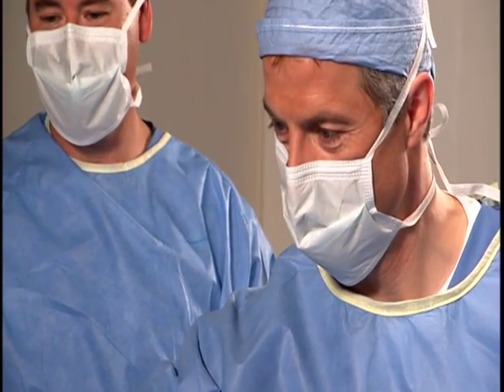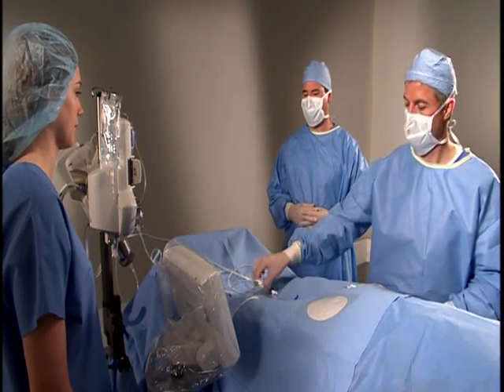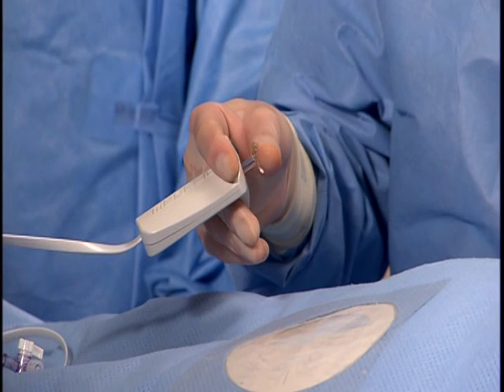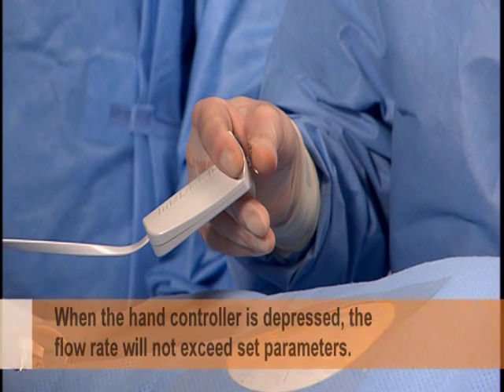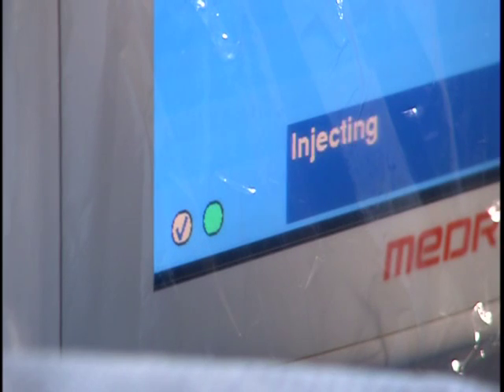During contrast delivery in variable flow mode, the injection is started with the initial depression of the hand controller. When depressing the hand controller, the flow increases in increments of 1/10 of the set flow rate. Depressing the hand controller halfway will deliver half of the flow rate, while full depression delivers the entire flow rate. When the hand controller is depressed, the flow rate will not exceed set parameters. Releasing the hand controller stops the flow. The injector remains armed for the next injection.